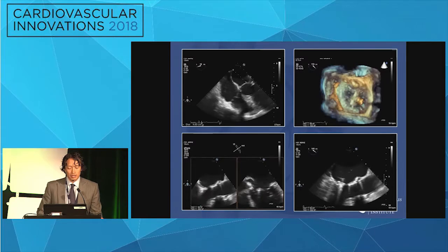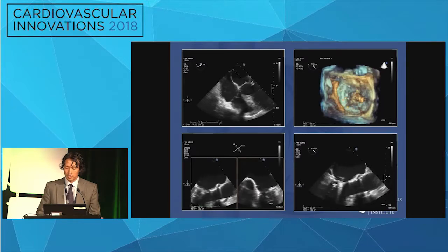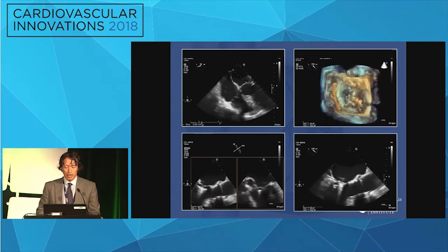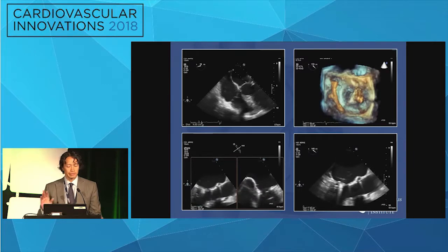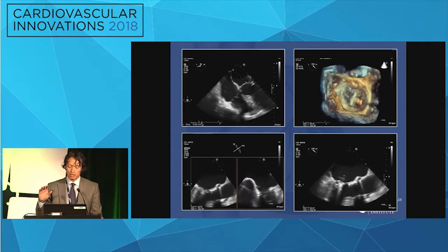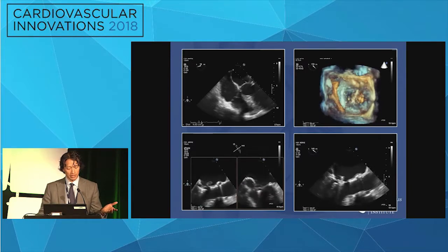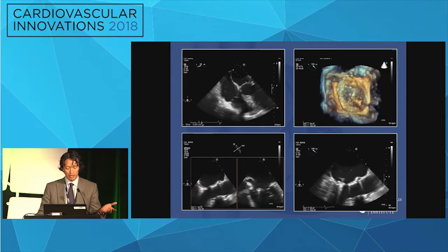So here's a transseptal, and you can see the height here. This was with the standard NT, height was 4. And then we brought the clip here in the top right-hand side. And it actually took no more than 10 minutes. It was actually really easy to get down, get underneath the valves. You can see there on the lower left-hand side, the clip, the leaflets fell right in.